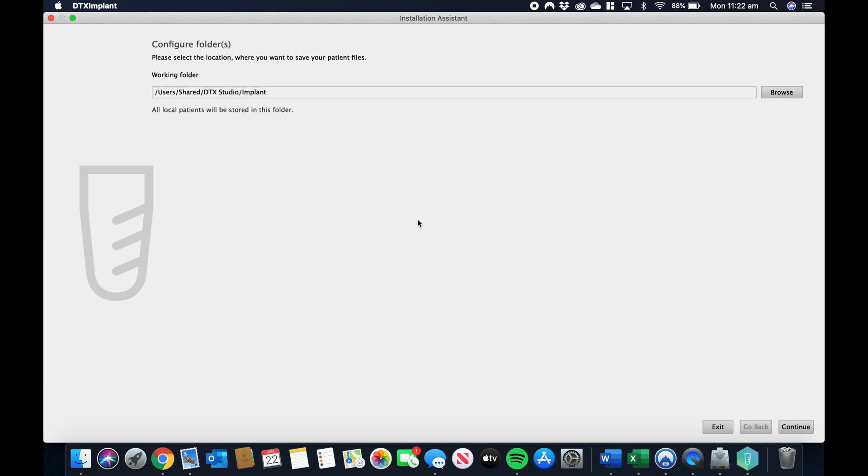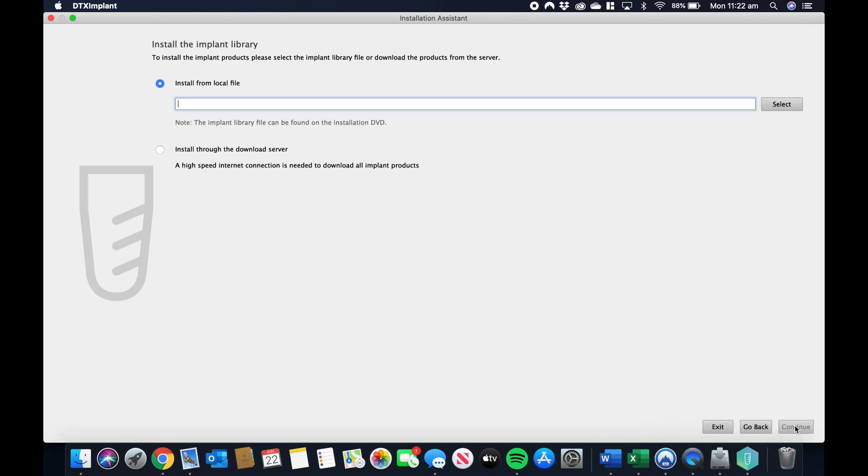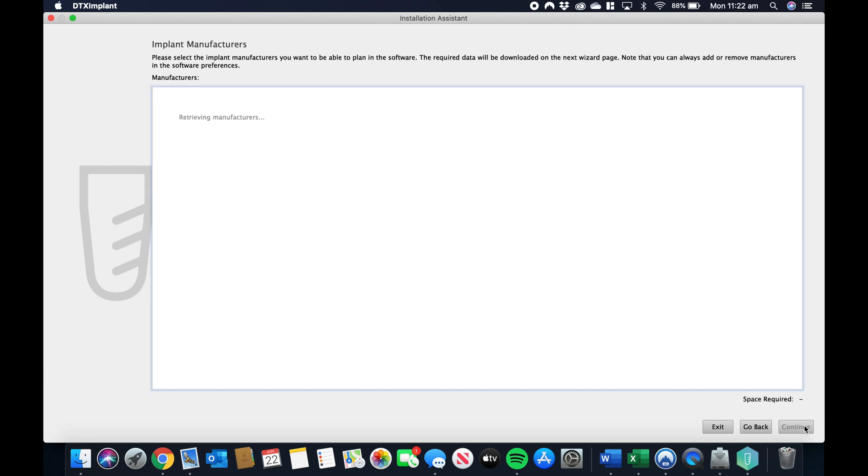And then you're going to need to download the library. For this example, I'm just going to download the Noble Biocare library, but you can download any library in our list. Press continue.